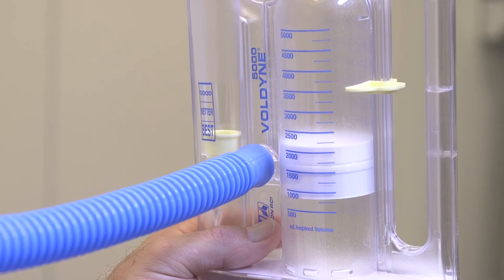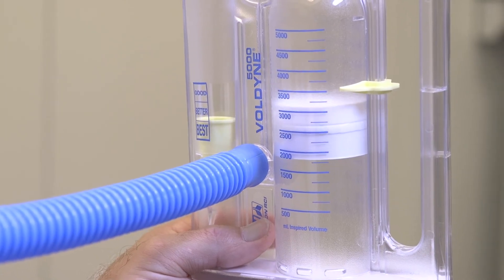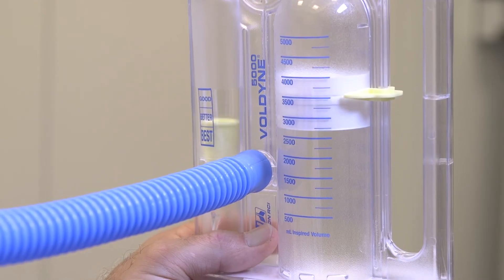Now rest and breathe naturally for a few breaths before taking your next deep breath through the IS. Try to get the piston to the same level each time you take a deep breath. If you feel lightheaded, slow down. Place the goal marker at the maximum level you reach.